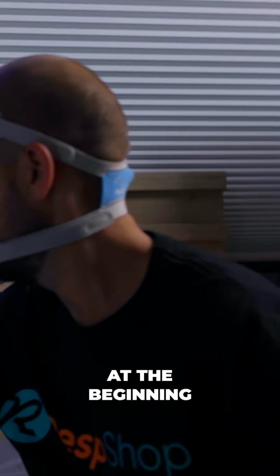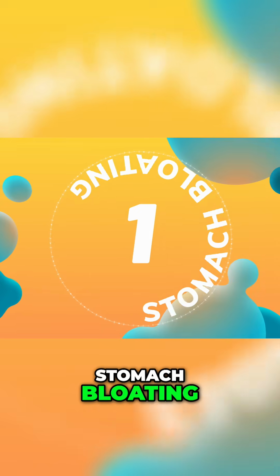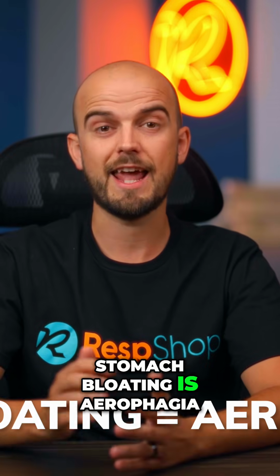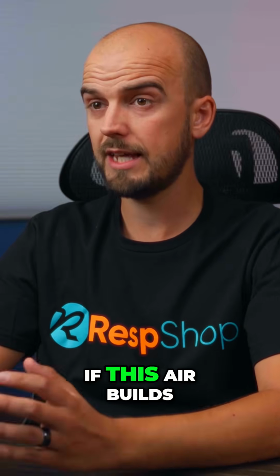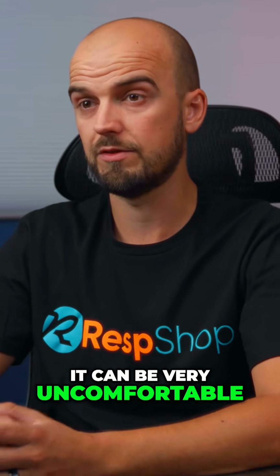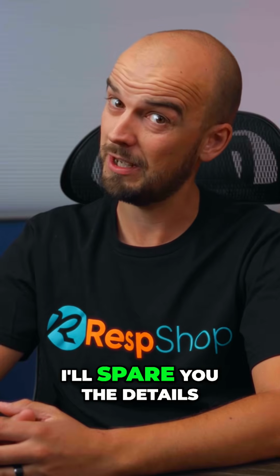It can be hard at the beginning, but trust us, it's worth it. So let's start with problem number 1, stomach bloating. The proper name for stomach bloating is aerophagia, and it happens when you swallow air into your stomach. If this air builds up too much, it can be very uncomfortable, and at some point, that air will have to escape and, well, I'll spare you the details.